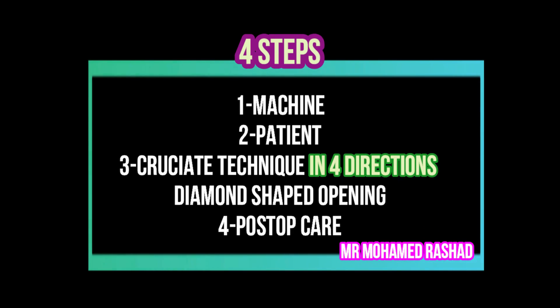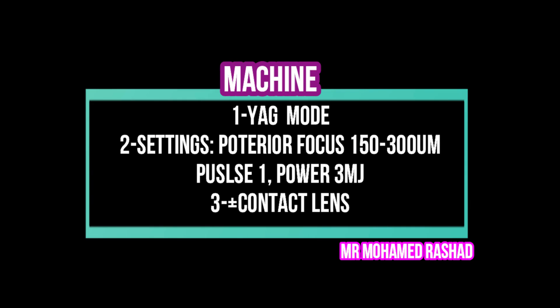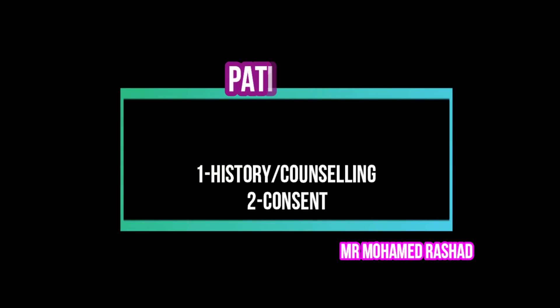In small pupil cases, we follow our four steps but with some modification. In the cruciate technique, we have to do it in four directions. First, we have to check the machine — the most important thing is to set the posterior focus, the pulse to one, and the power to nearly 3 millijoules.